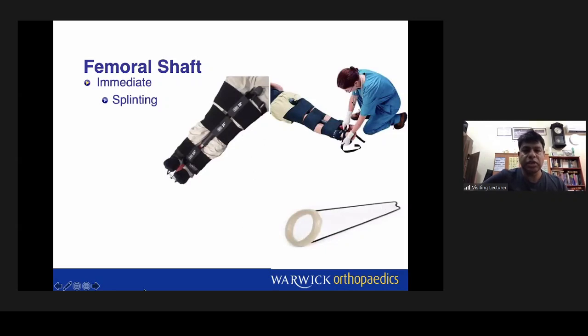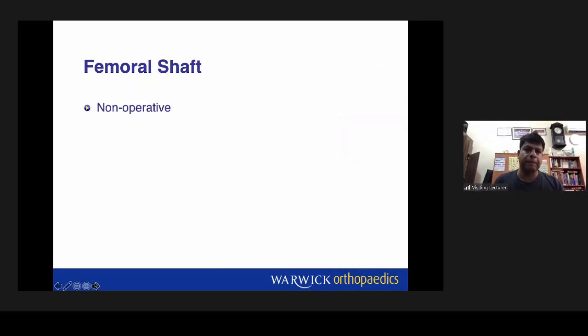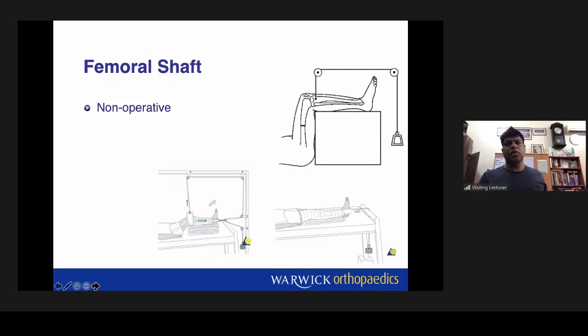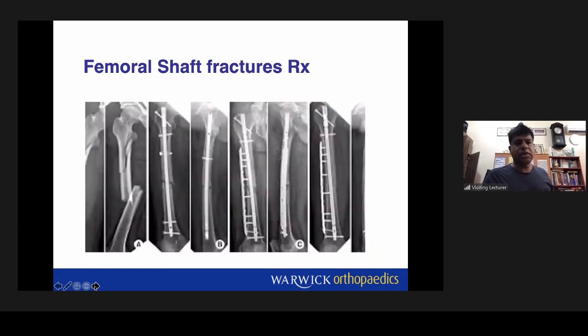This is called a Thomas splint. This is another thing we used to use. Now we don't use it much. You put the strap there and then you put a bandage here and pull this, and then this gets straightened. Earlier they used to do traction, non-operative management. Now we don't do this, we always operate. It's an old traction. In younger patients, we still do it.